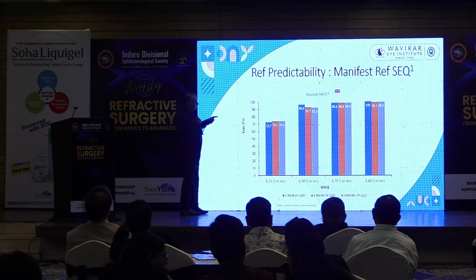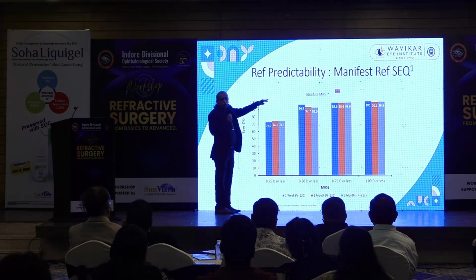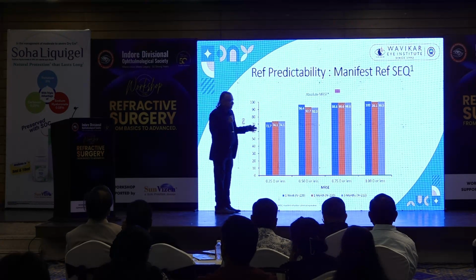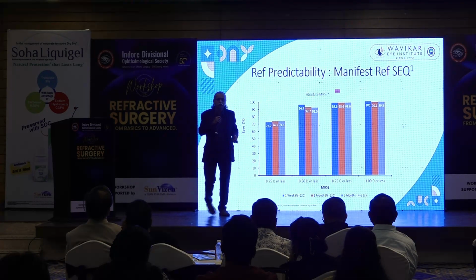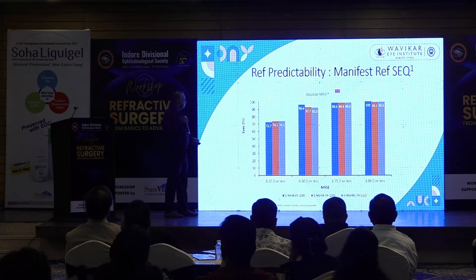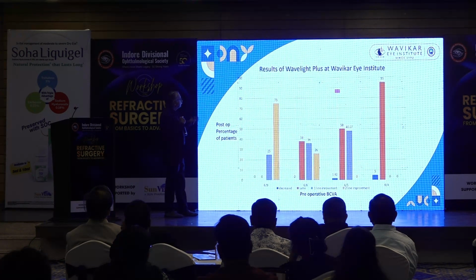This is something which I was surprised about, is that whatever their manifest refraction was and what the result was, they were within plus or minus 0.5 in very large number of cases. In reality, all of us, I am sure that very few of us are getting so much of refractive surprise after surgery. Patient satisfaction, very good. Now these are results at Wavikar Institute.